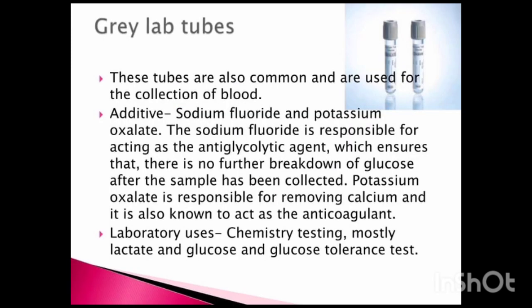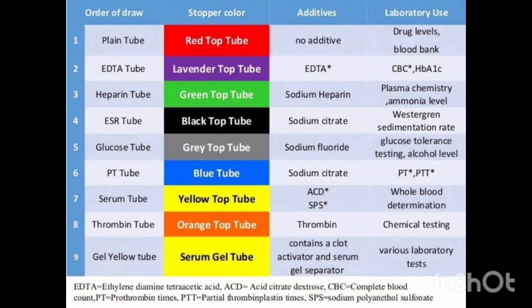Next is grey lab tubes. These are also used for collection of blood and for the chemistry testing of lactate, glucose and glucose tolerance test, and they contain the additives sodium fluoride and potassium oxalate so that it prevents the breakdown of glucose in the collected blood sample.